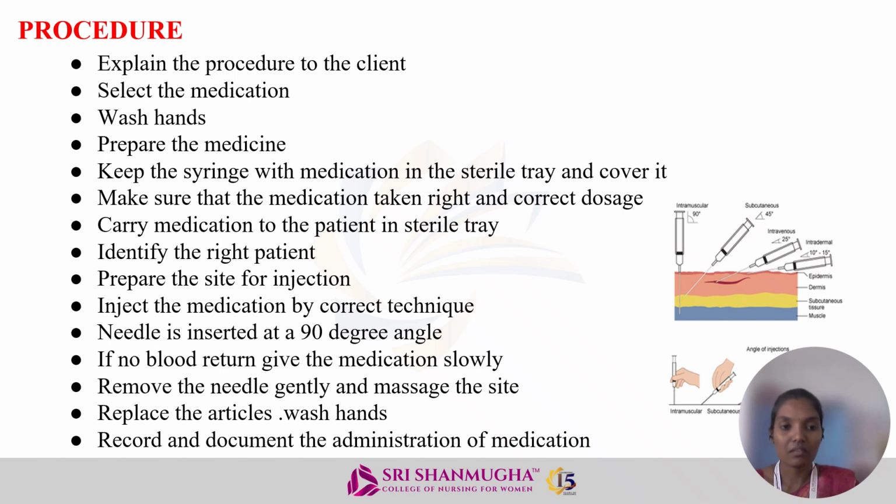Next, make sure that the medication taken is right and the dosage is correct. Next one, carry the medication to the patient in a sterile tray. Next, identify the right patient, prepare the site for injection, and inject the medication by the correct technique, which we have to follow.